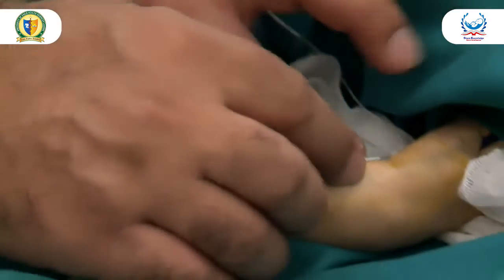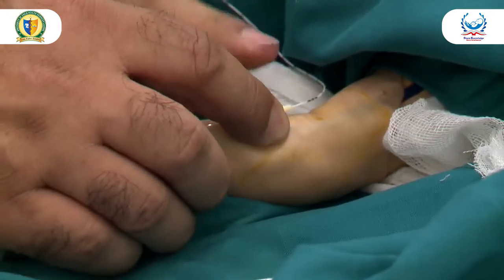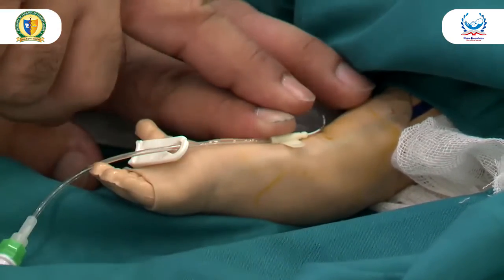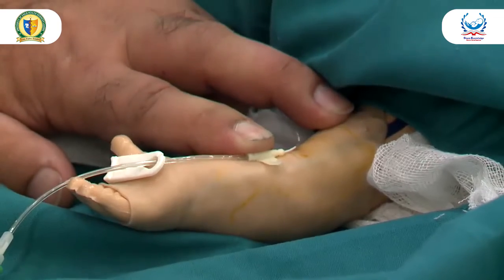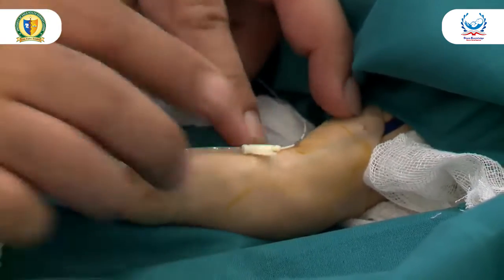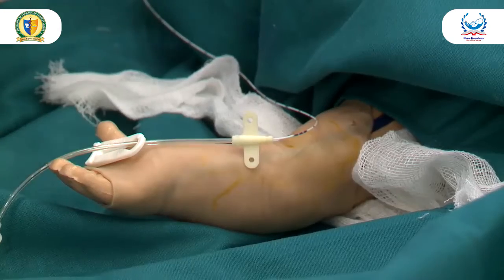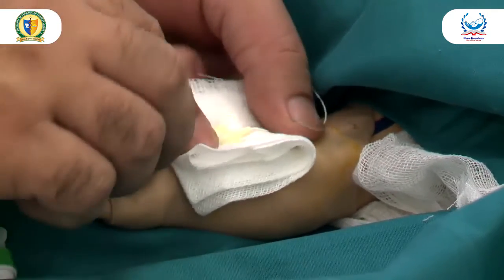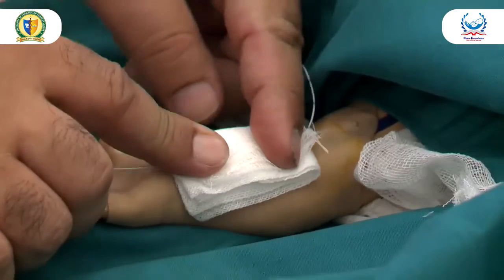If you have that butterfly thing, you will just put it like this, and it is better to leave the entry site where you can see it. But in the other type of cannula, which is silicone, where there is a hub, because the hub is a bit thicker and coarse, you put it like this and cover it with this.